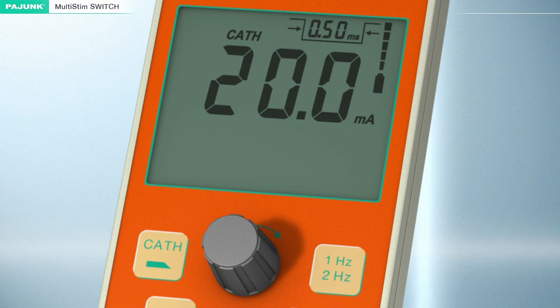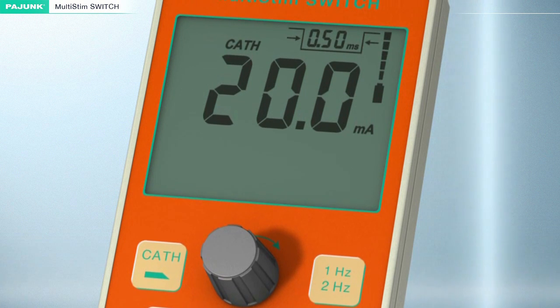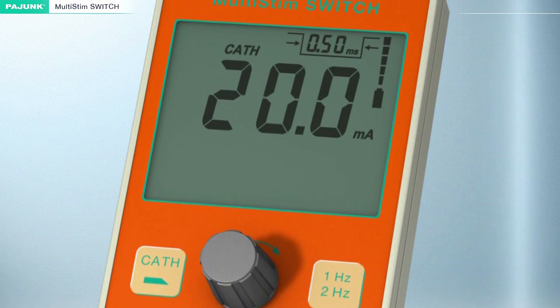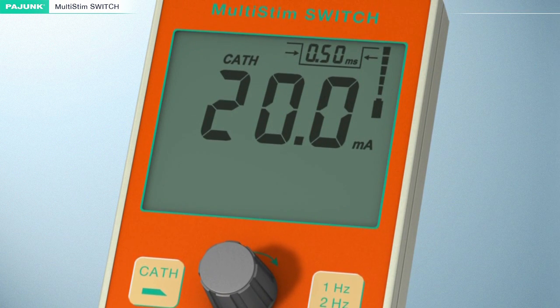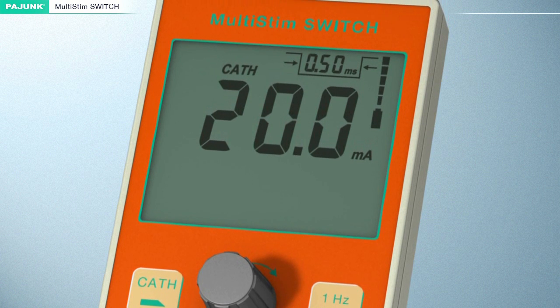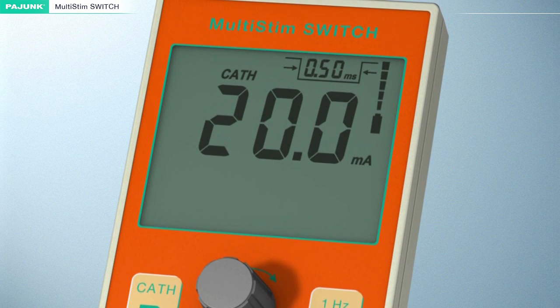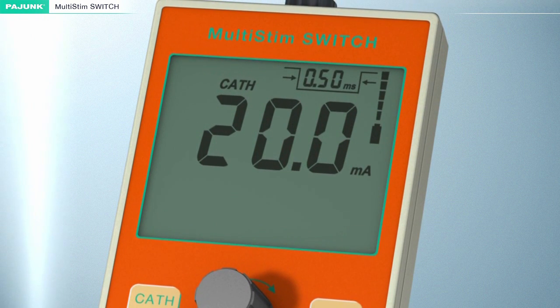The intensity and the frequency of the stimulation current, as well as the impulse bandwidth, can be adjusted and preset separately at any time for the two outputs, cannula and catheter.